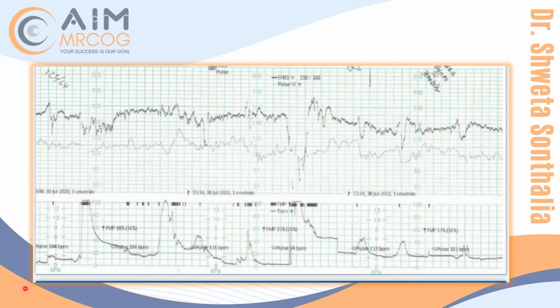Okay. So now if you see the contraction, you have to... It is the best ever session in CTG that I have attended. Thank you so much, Anam. So if you see the contraction, you told me 4 contractions in 10 minutes, if I'm not wrong, right? Yeah, 4. So as I told you, in some CTG here in UK, it looks exactly like this. So 12, 10, as I told you, this is the uterine pressure.